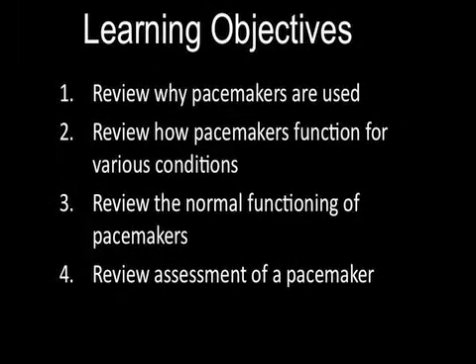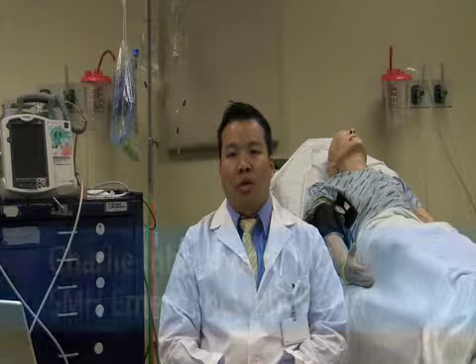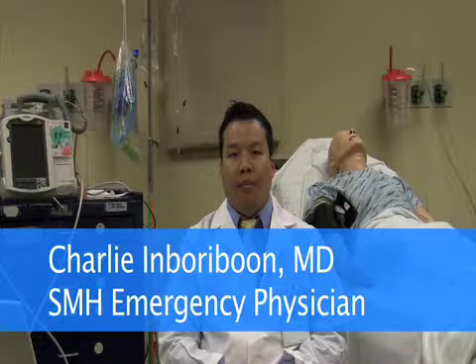After viewing this episode, participants will review why pacemakers are used, review how pacemakers function for various conditions, review the normal functioning of pacemakers, and finally review the assessment of a pacemaker. Pacemakers are usually used for bradycardia.